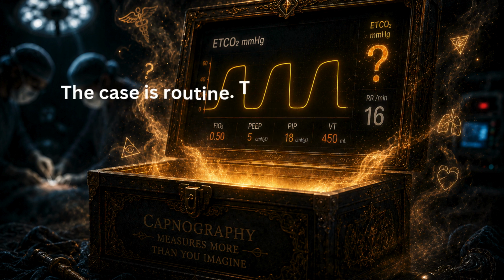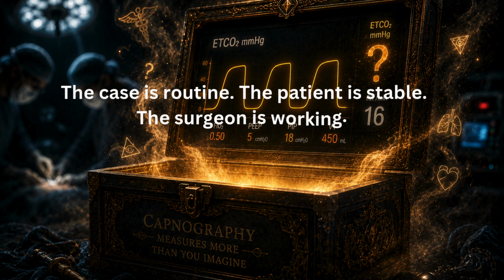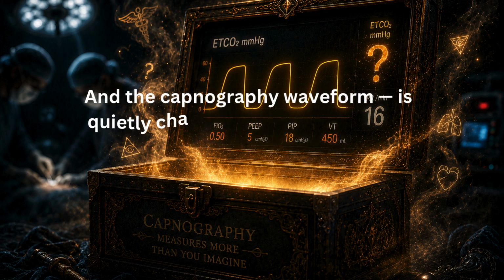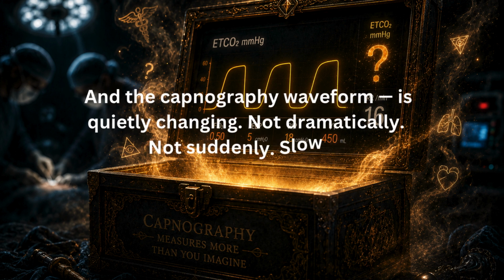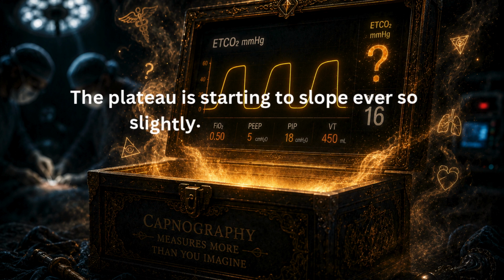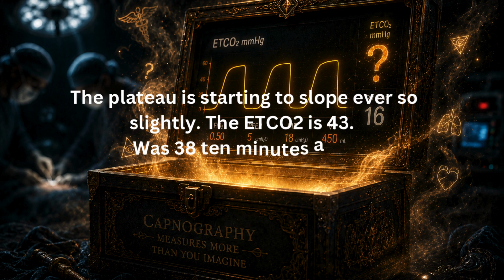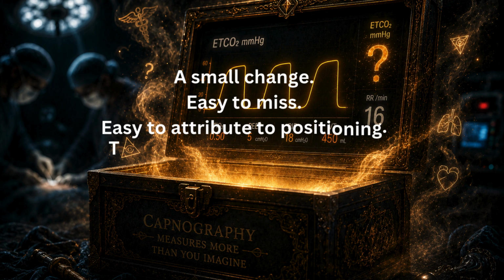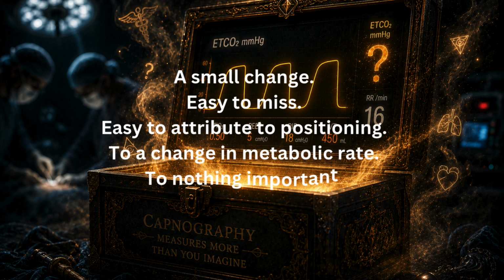This is what it looks like in the real operating room. The case is routine. The patient is stable. The surgeon is working. Someone put music on. And the capnography waveform is quietly changing. Not dramatically, not suddenly, slowly. The plateau is starting to slope ever so slightly. The ETCO₂ is 43, was 38 10 minutes ago. A small change, easy to miss, easy to attribute to positioning, to a change in metabolic rate, to nothing important.